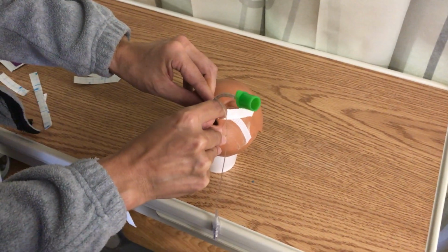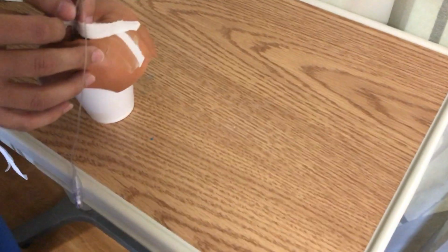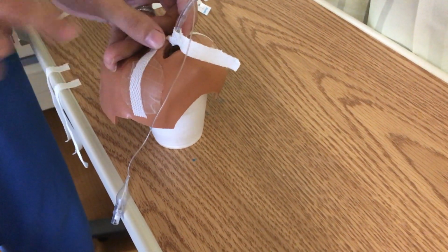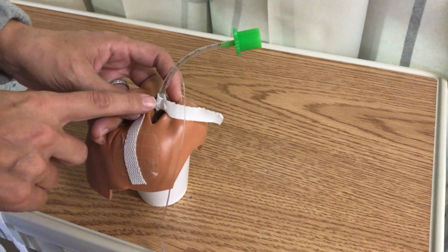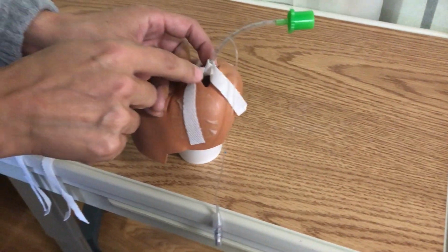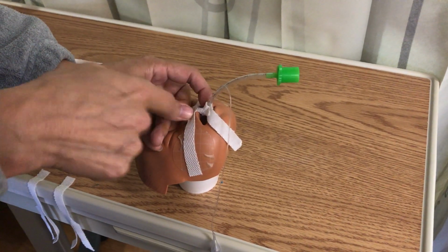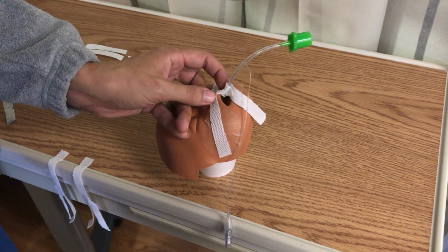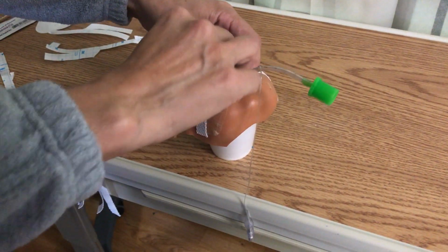This piece right here, if this tail right here is too long on the bottom piece and it gets stuck to the tape on the other side, it's going to be extremely difficult to get that off if you have to retape. In addition, when you go to wrap this around, you're not going to have adhesive sticking to your tube all the way around. This is going to be folded up under there, and that will actually decrease the security of the tube because that part won't be sticky.